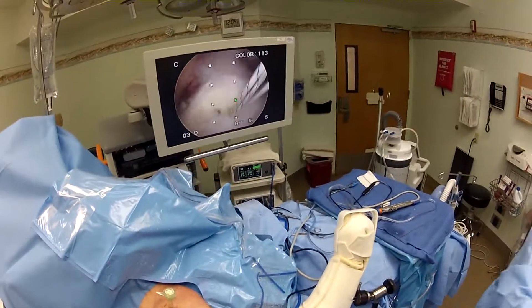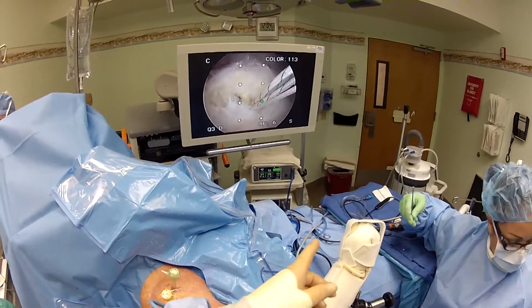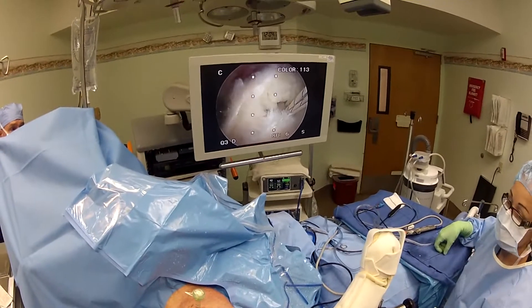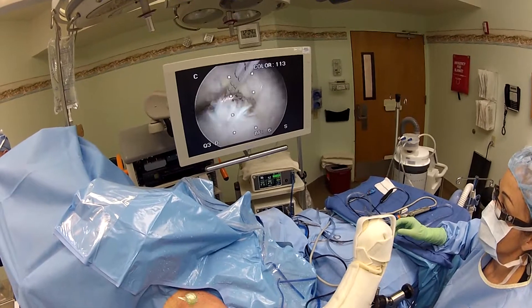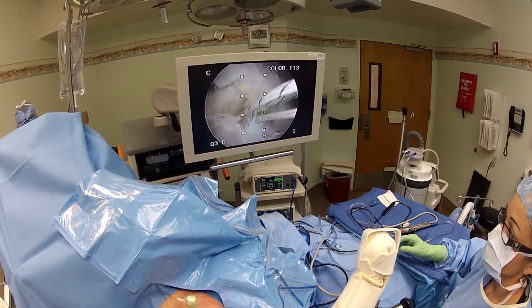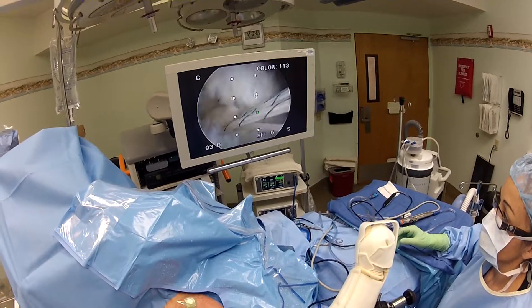As you can see here, he has a split-type tear with some of his tendon still attached to the greater tuberosity. You put the anchor down into the greater tuberosity. You can see the humeral head right there.